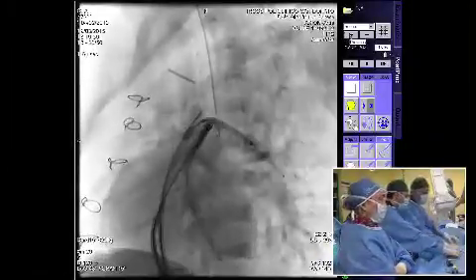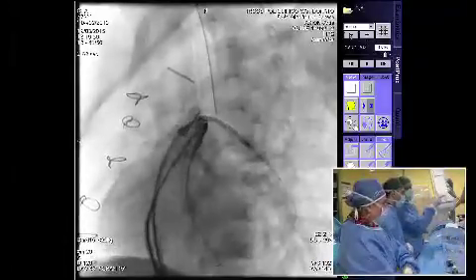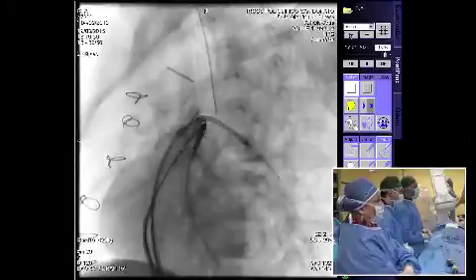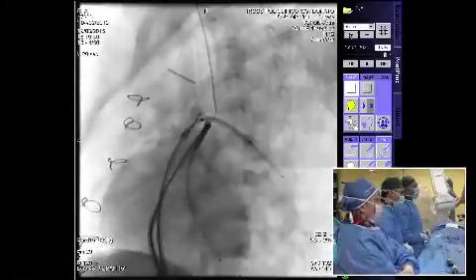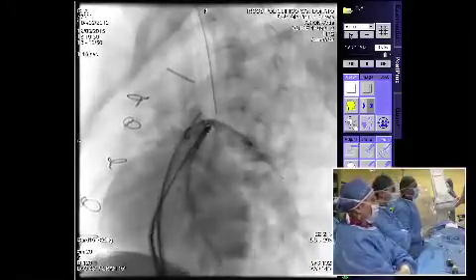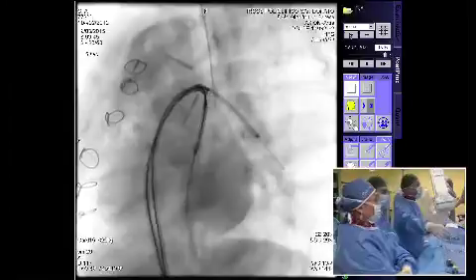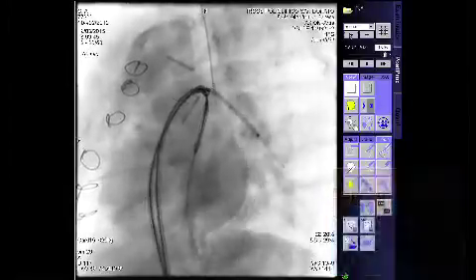Fine. In this particular case, when you have a very big pulmonary trunk, you could inflate one balloon and after the other. We save this approach only if we have a severe stenosis involving both original pulmonary branches. You have enough space to inflate without any difficulties the right and after the left. Even you can retrieve one of the stents inside the sheath in order to do a very good angio.